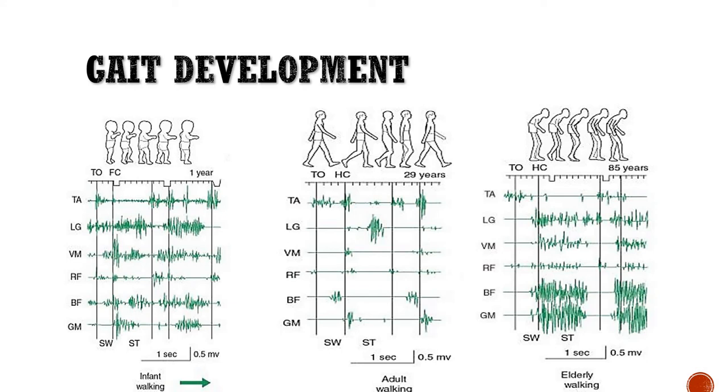this is obviously between the contralateral limbs, and once the tibialis anterior switches off, the lateral gastrocnemius comes on. There's a small, very brief area where the medialis is engaged, the rectus femoris is engaged at 4 specific, very discrete moments in the gait cycle.